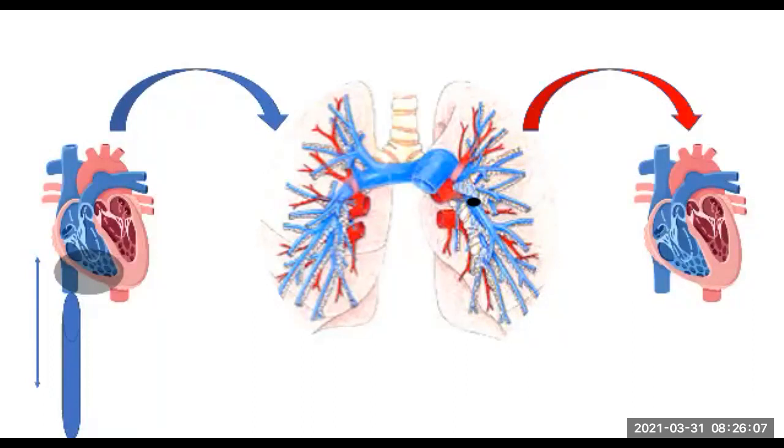That's why I say we're going to spend a bit of time on this just to try and logic it out before we get into the actual ultrasounds themselves, all right? So that's the first thing that we expect to see in the acute phase, all right?